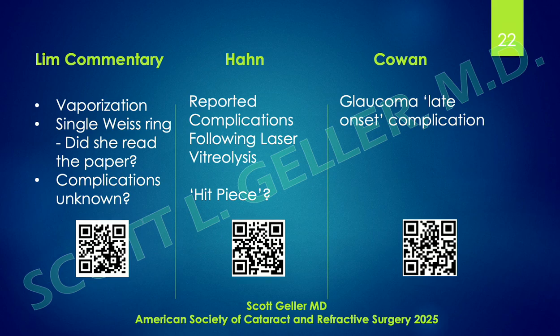They can only say that the complication was observed months after the procedure, and there was no observation immediately after the procedure. And I can tell you from my own experience that elevated intraocular pressure does occur in certain cases, usually 24 to 48 hours after the procedure.